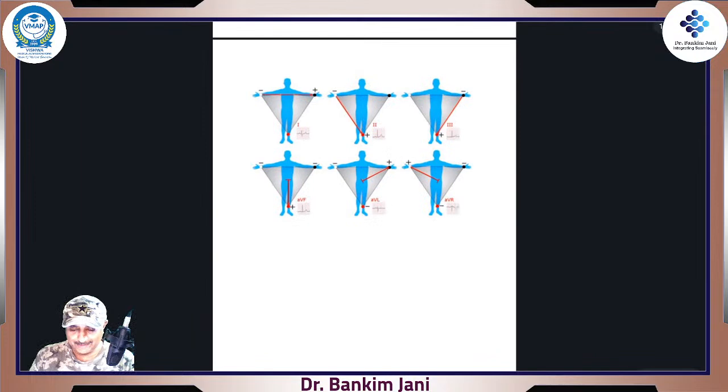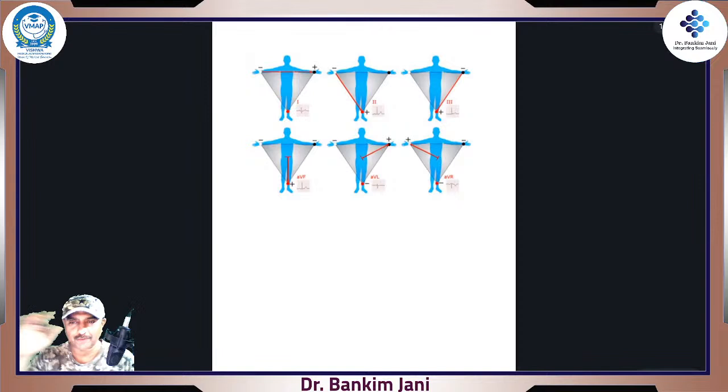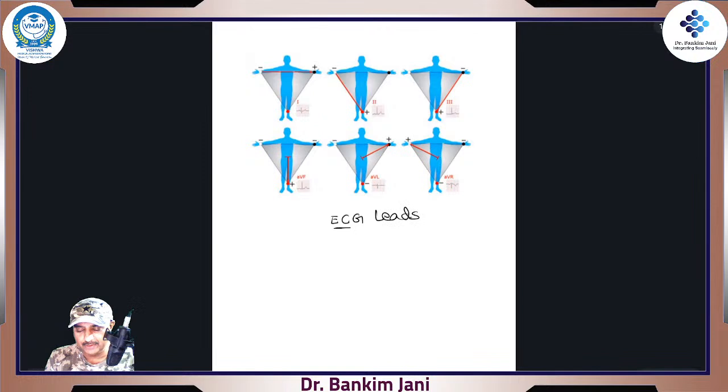So now, a bit of geometry, right? That's the best thing about this medical subject. It's a combination of everything: physics, electronics, and mechanical things, even geometry. So let's simplify things. ECG leads, right? They are called the leads.